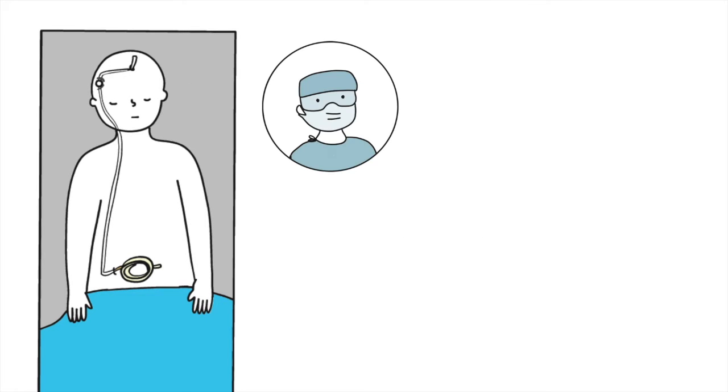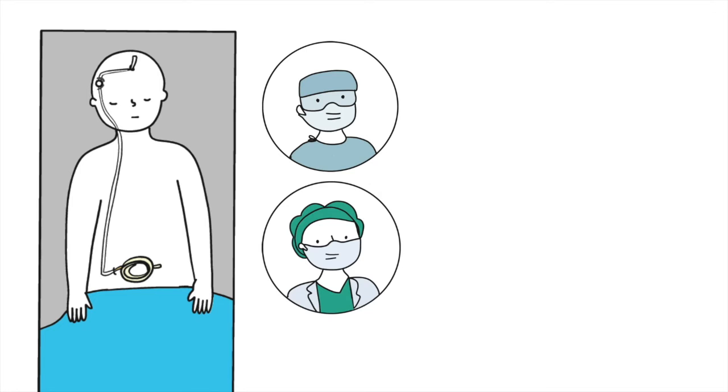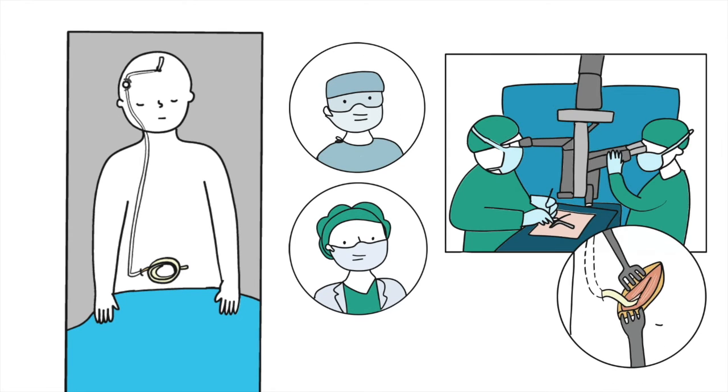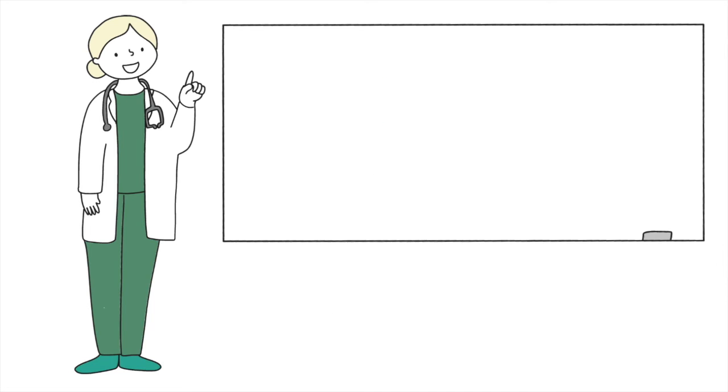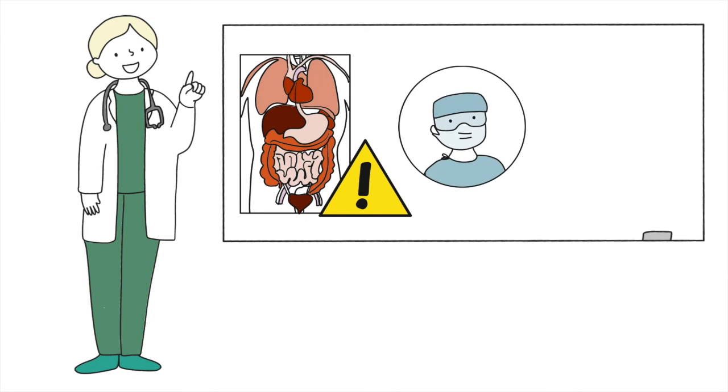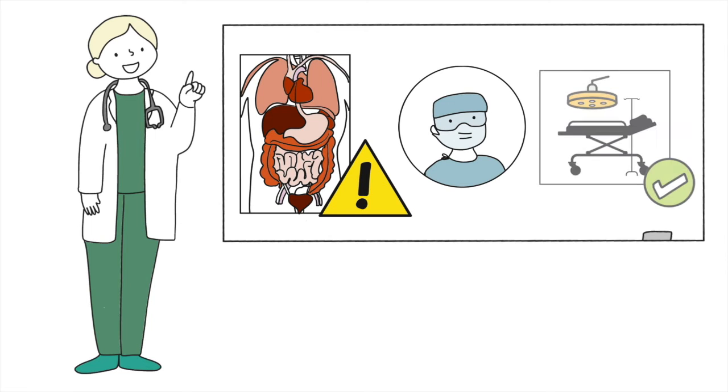In some situations, the neurosurgeon may have a general surgeon place the catheter into the peritoneum using laparoscopic cameras to ensure good placement of the catheter. If you have had prior abdominal surgery or surgeries, please make sure your surgeon is aware prior to your procedure so that he can determine whether a general surgery is needed for laparoscopic assistance.